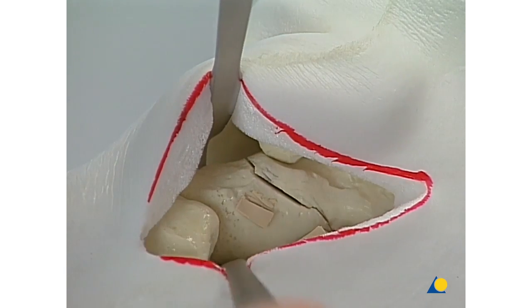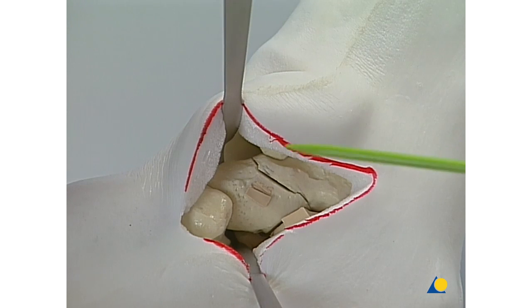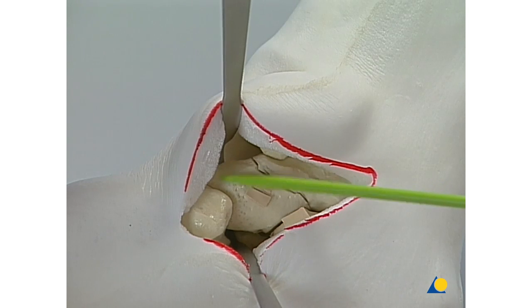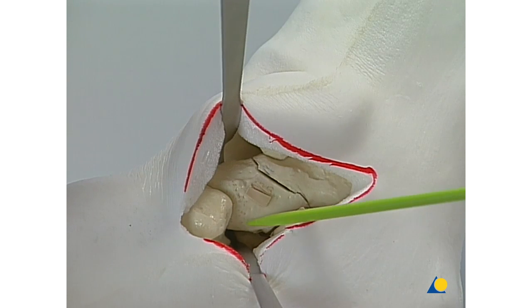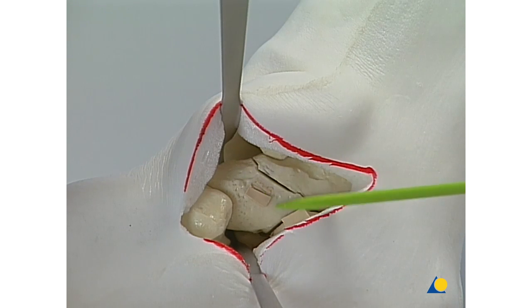Another small retractor is placed below the talar neck. Shown here are the navicular and the talonavicular joint. This is the talar neck and the talar fracture which ends below the sustentaculum tali.